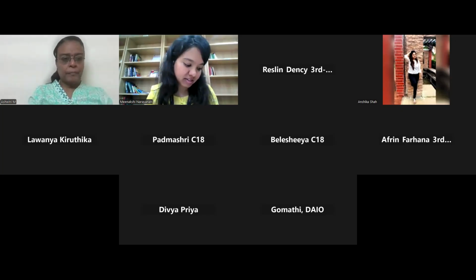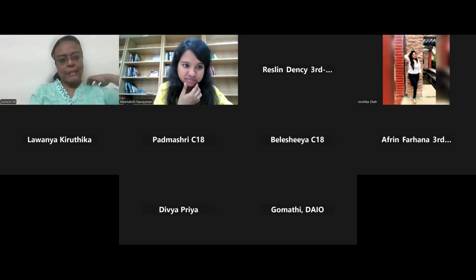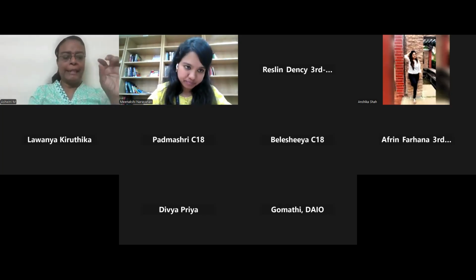Next question is, if there is guttata, how will it be seen in slit lamp? So this is kind of related with the previous question, I guess. So you'll be seeing it like a defect in the corneal layer, an empty space kind of thing in the corneal layer.